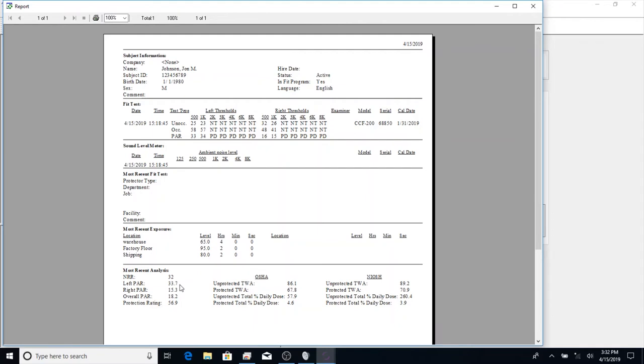Below that, we see the left and right PAR. The PAR is the personal attenuation rating, so this is how much protection he was getting from that plug. We can see for the left ear, he was actually getting more than what they're rated for, which you do see occasionally.